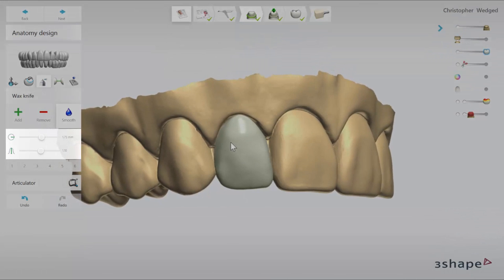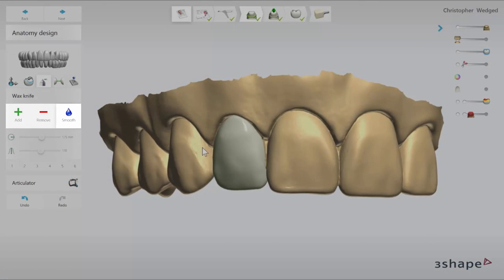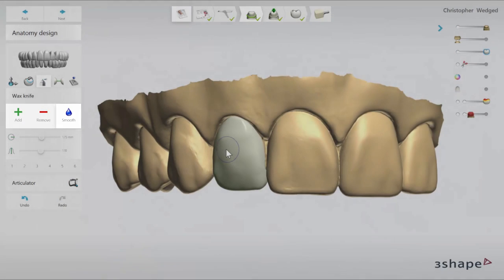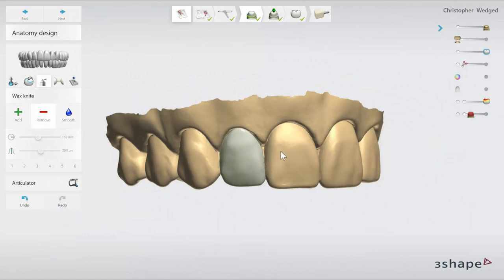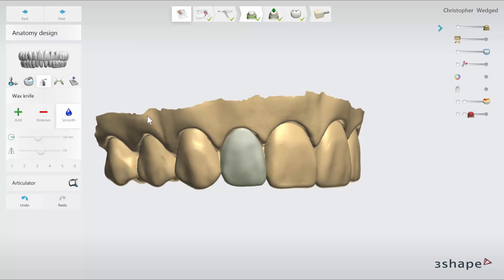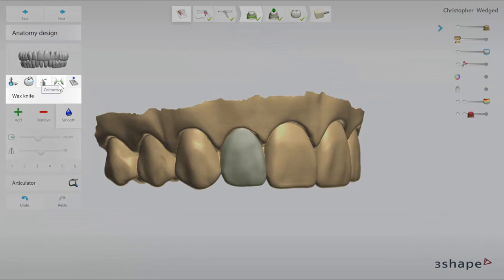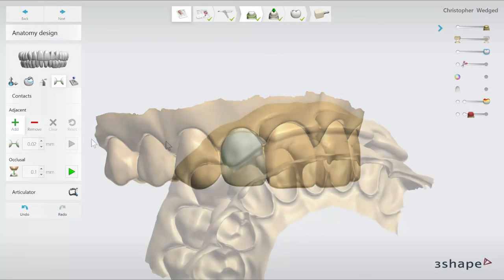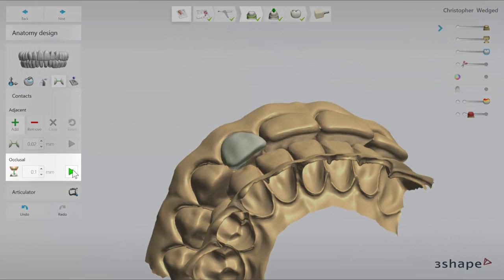By using the design tools you can add, remove, and change the shape of the design and make it smoother. Now you can go to the contacts tools. Among these tools you will find the occlusal button, where you can set the distance value and enforce it.